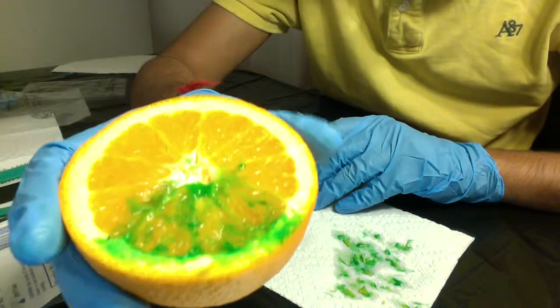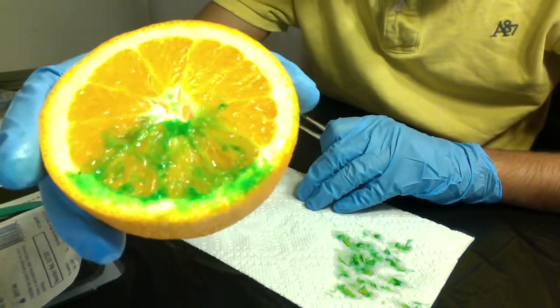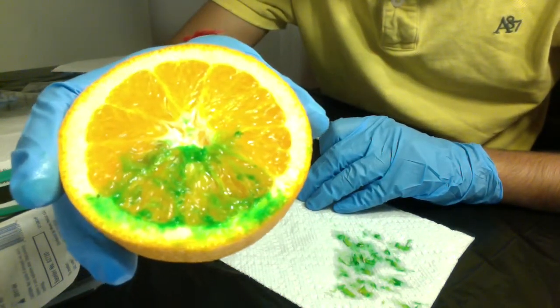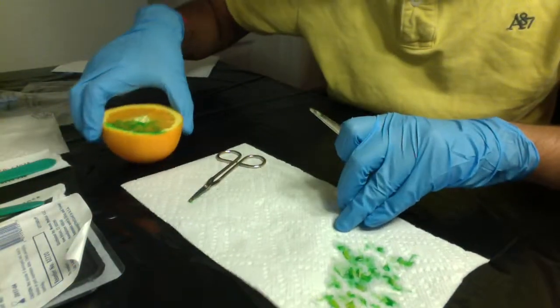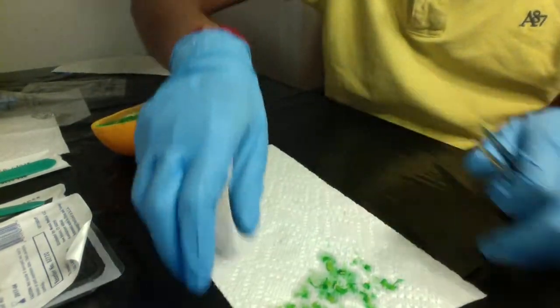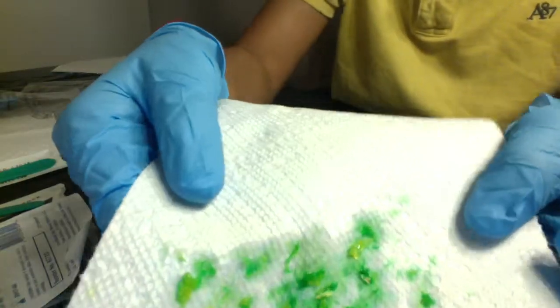This is my orange after the debridement. There's some tissue still there in the green area, and you see these are the flakes.